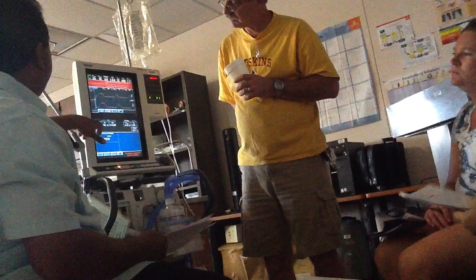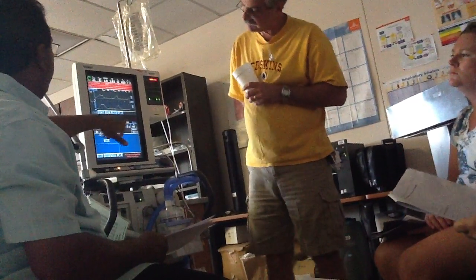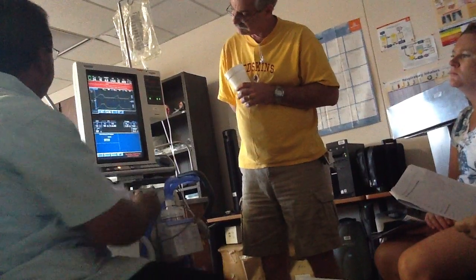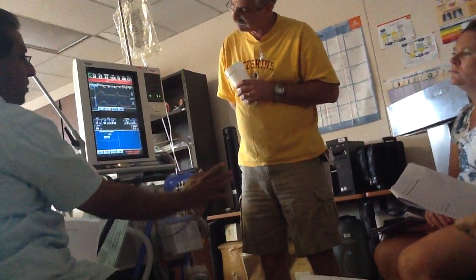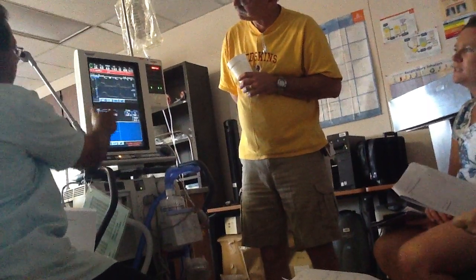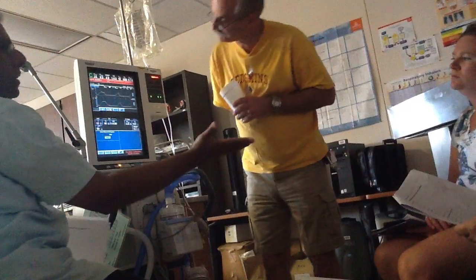Okay, look over here. Patient is on assist control now. PCV. Pressure trigger. Look at this. Frequencies are there. No tidal volume showing up anywhere except the exhalation. And IE ratio, everything is set, is right there.